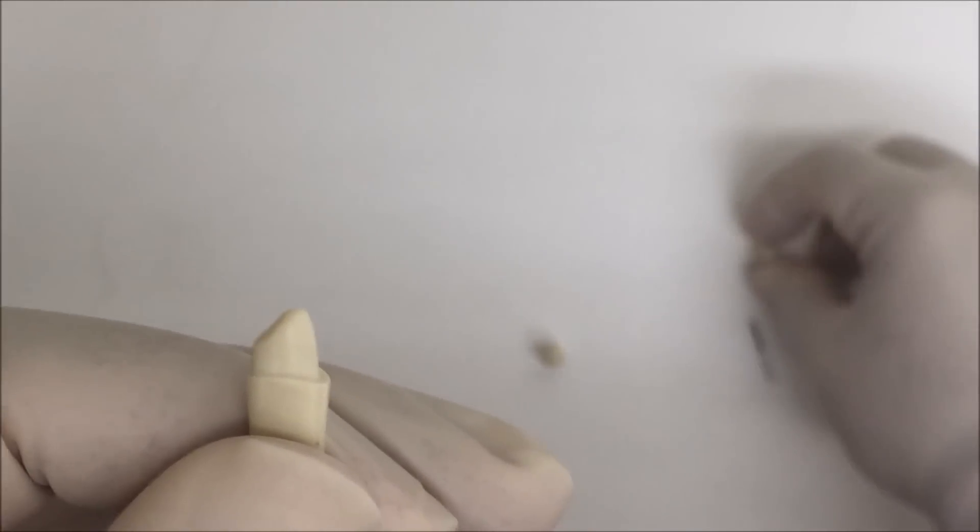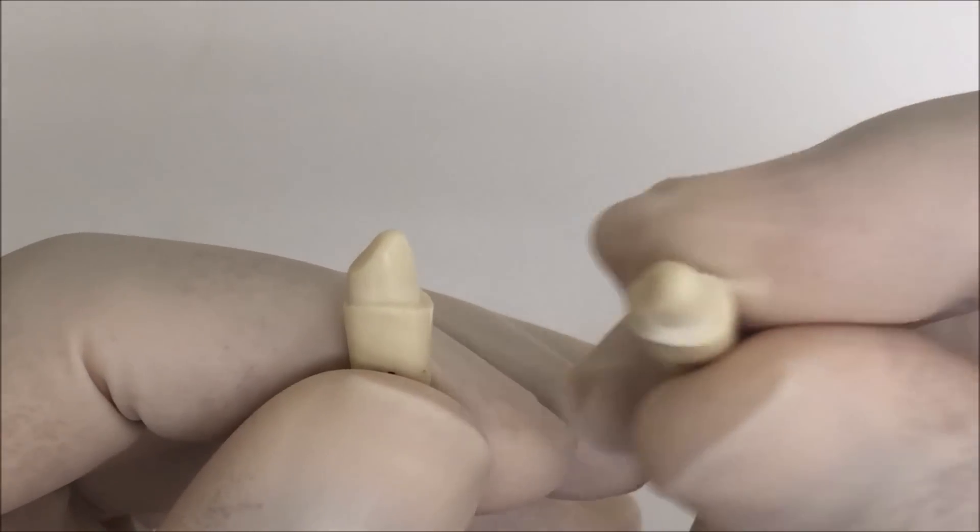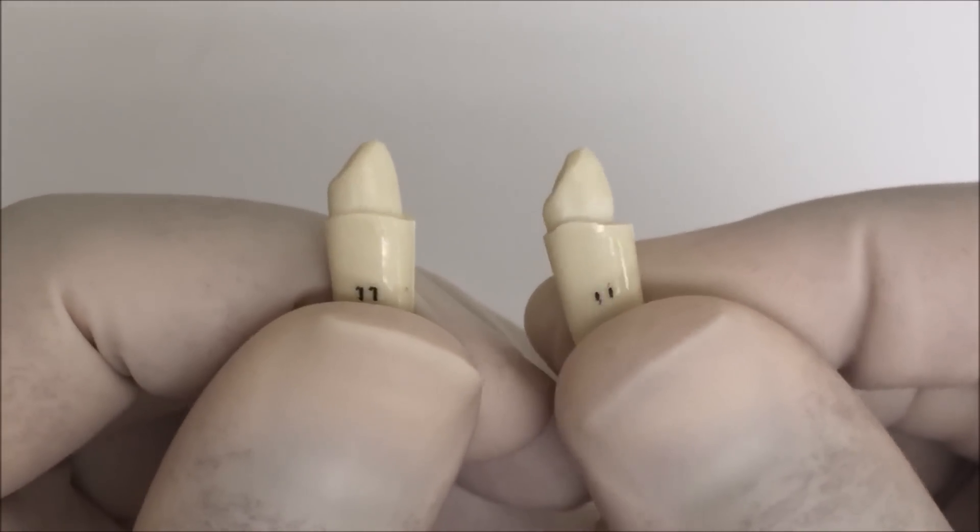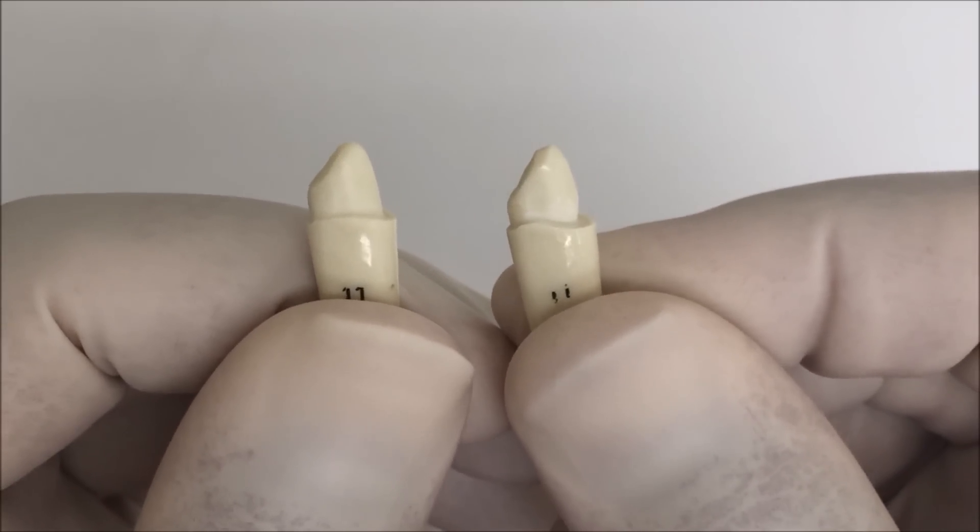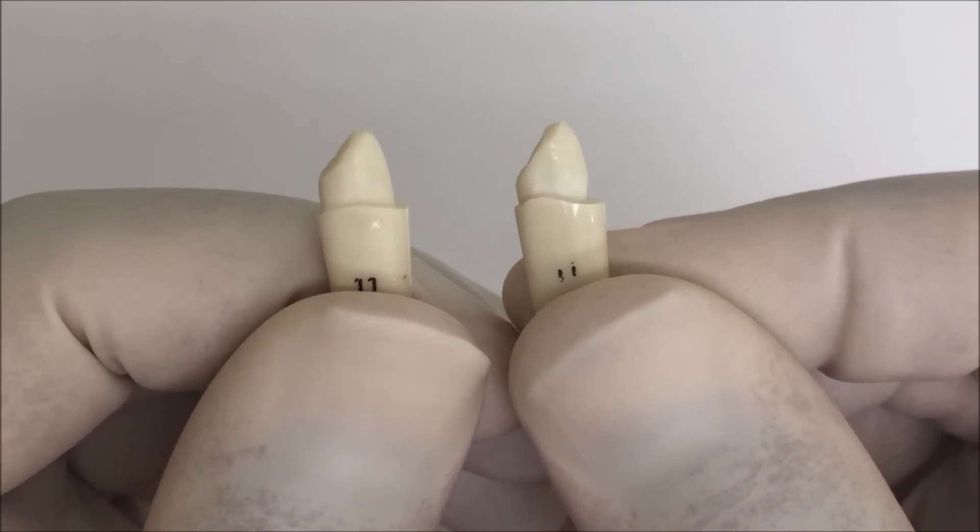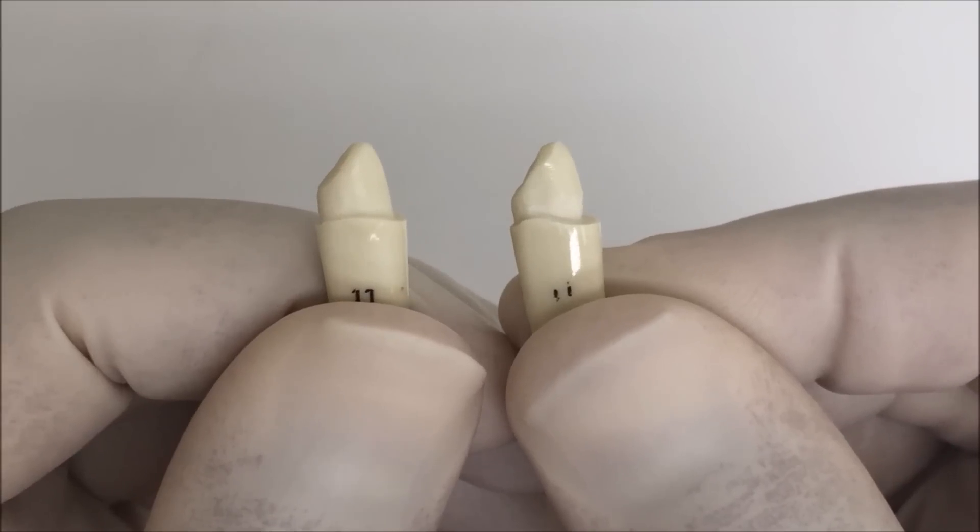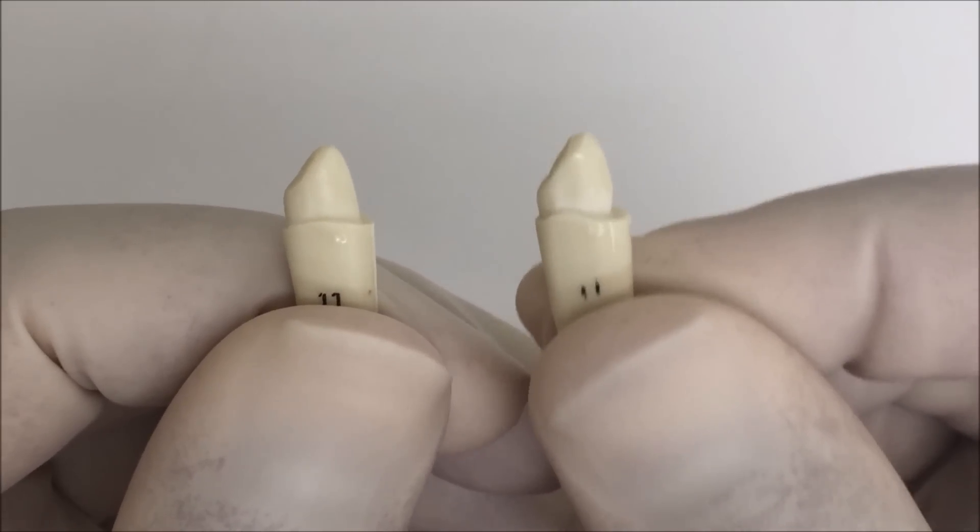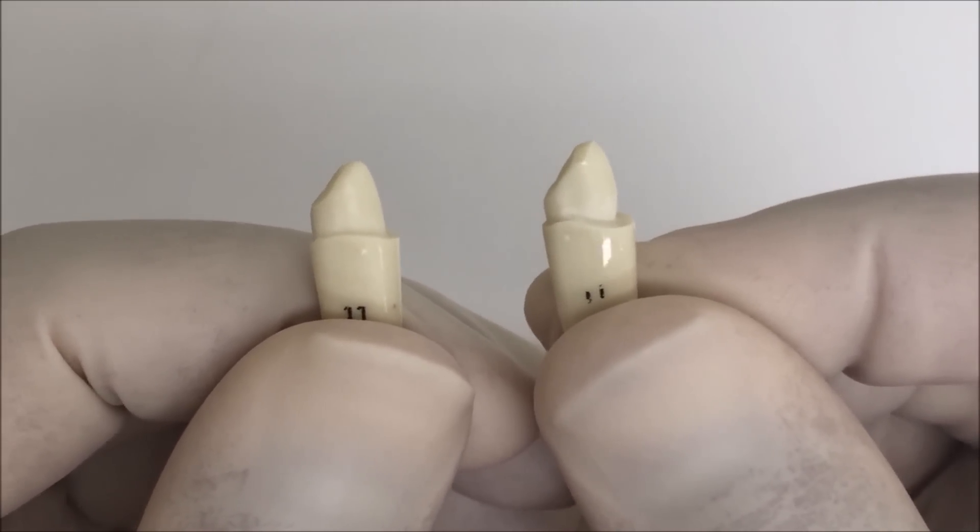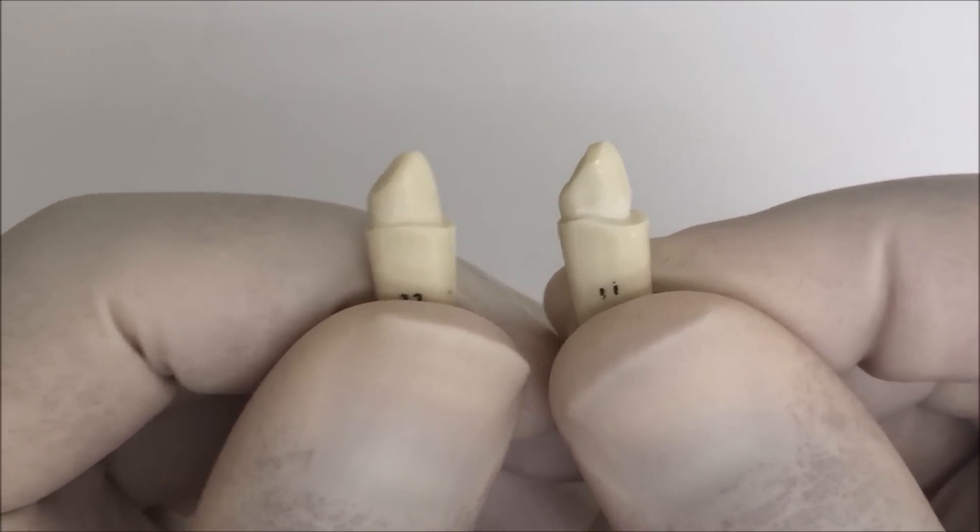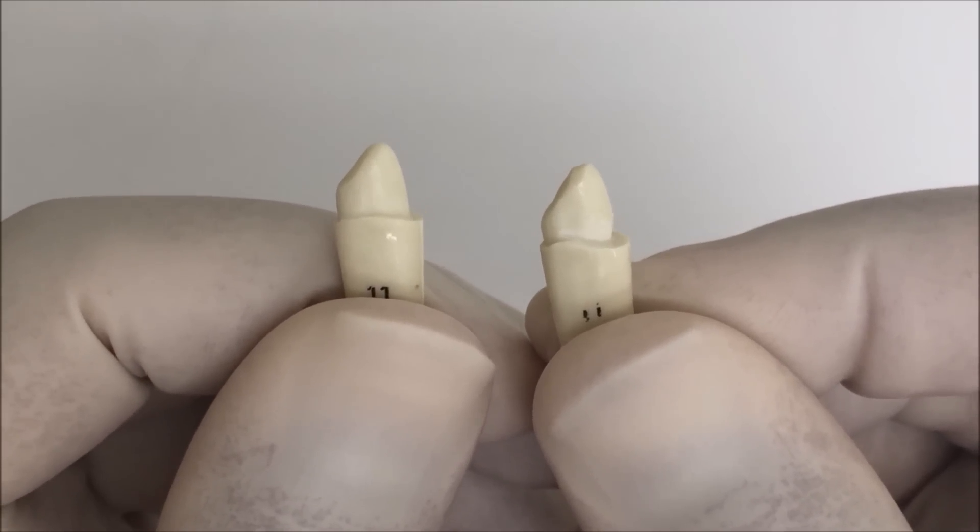The undercut is checked by viewing the tooth proximally from proximal view. You can see here the difference: the one on the right hand has undercut labially, and the one on the left doesn't have undercut and has good taper. So this is the second method.